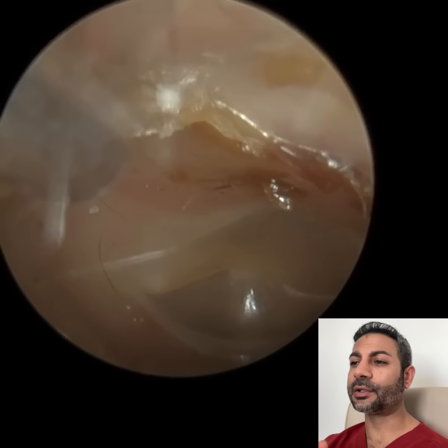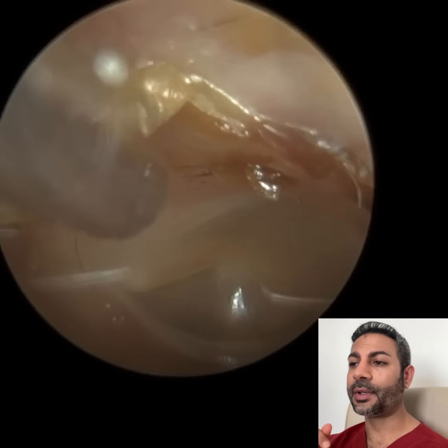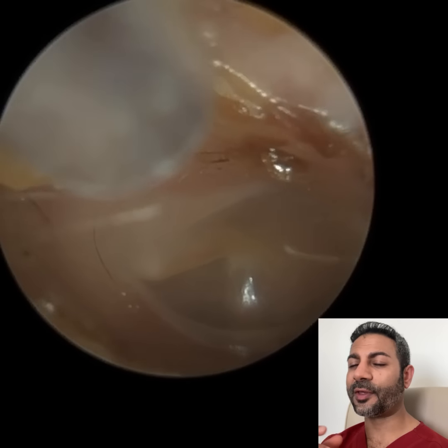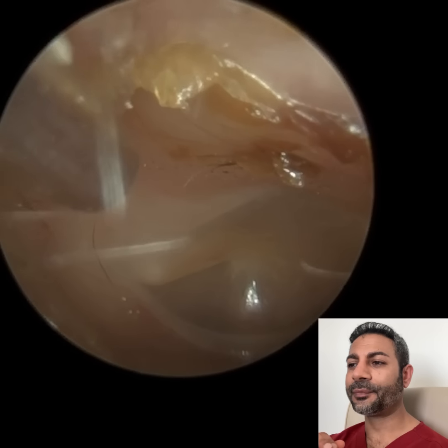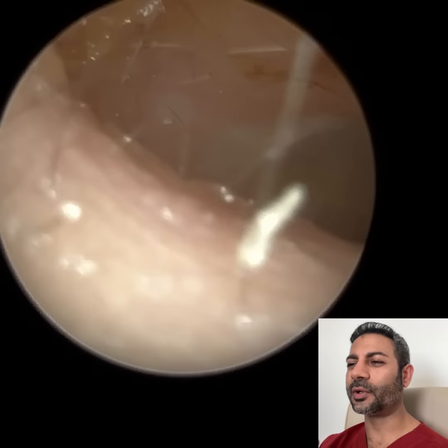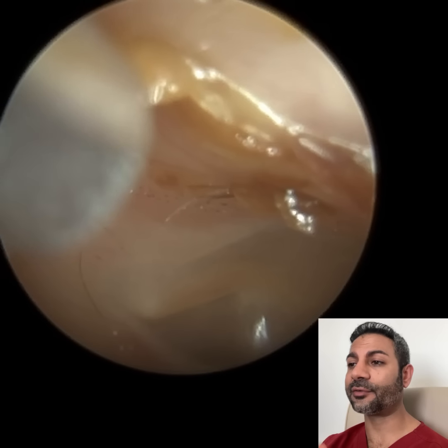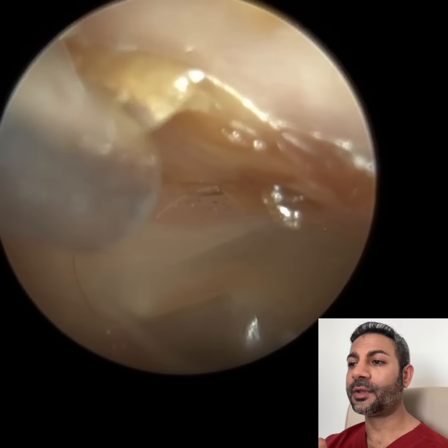The other strain that typically can cause otomycosis or fungal infection in the ear is Candida, but the appearance of that is more of a thick, creamy debris, and it's quite medial on the eardrum, where the eardrum is warmer and moist, and darker in appearance. So it's more of a better breeding ground for fungal infections.